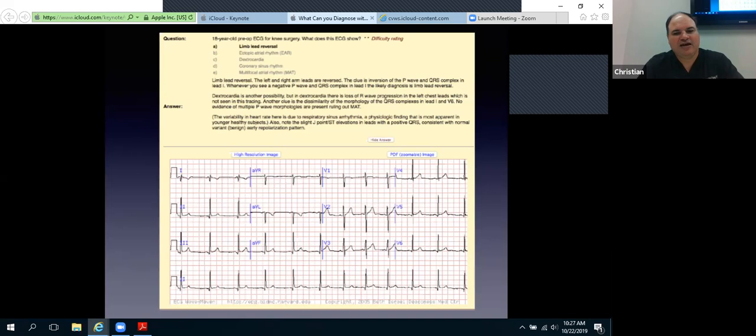So you need to know, is it sinus rhythm or not? And then the axis has to be determined. If all you walk away with is the basic aspects of the axis: left axis deviation, you should be thinking ischemic injury to the heart. Just that simple. And right axis deviation, you should be thinking that there's some form of right ventricular conduction problem. There could be pulmonary embolism. Those two simple things are how we triage an EKG for the emergent aspect, really simple.